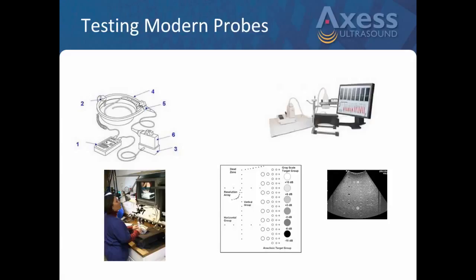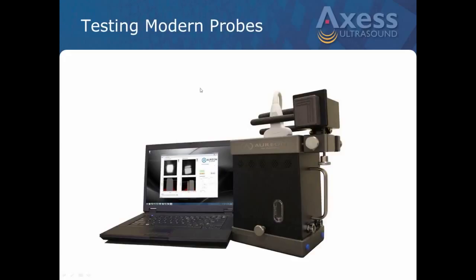The question about the cable, I can probably answer that for you right now. Using this device is one way, again the best way in my humble opinion, to identify whether it's the cable or the element. And what we can tell by this, just to share that with Chandra, is that a dead element is going to look one way on this test. We can see if there's a bad cable. Basically, the reading we get is going to look different. We can see that the cable is open, broken, etc., but yet the array is still performing. We still got a beam profile on the array. So that's how we can tell with that.